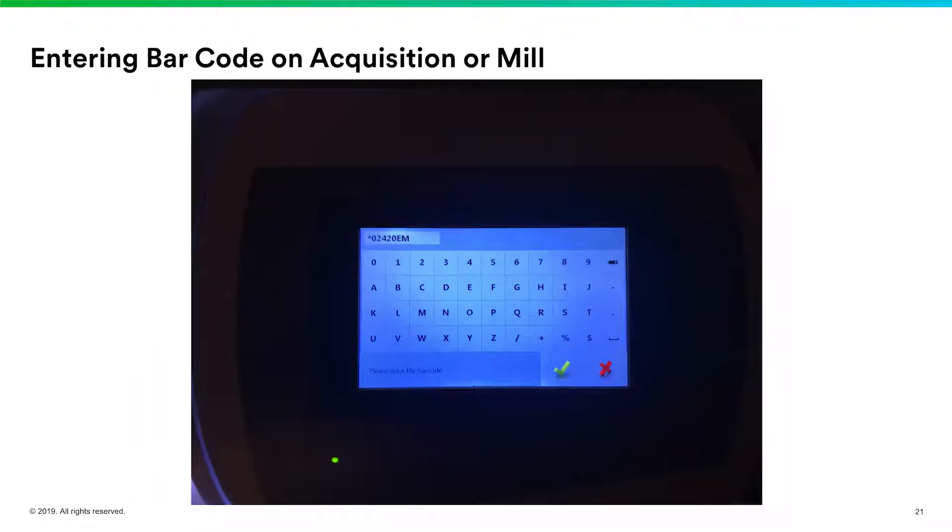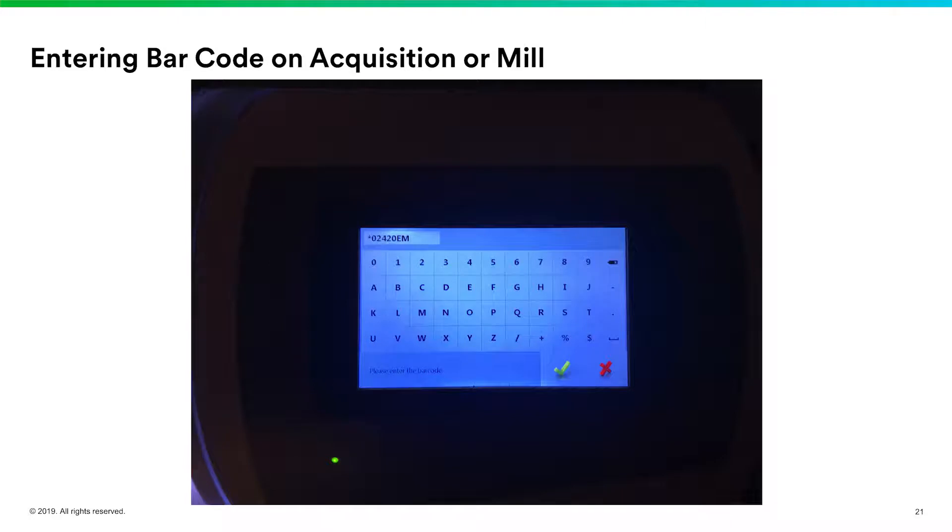When getting ready to mill these restorations, we have to enter a barcode. On the single unit block, we have a barcode or some numbers. Some milling units have a scanner that can automatically scan the barcode and enter it for you. We also have the option to enter the numbers from your keypad onto the milling unit. On my MCXL dry mill, it has the same keypad and numbers — you can hit start from your operatory, walk into the back, enter the numbers chairside or mill-side, and just hit that little green check mark and you're ready to go.